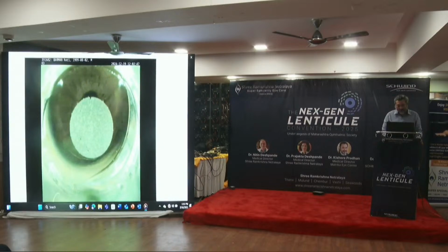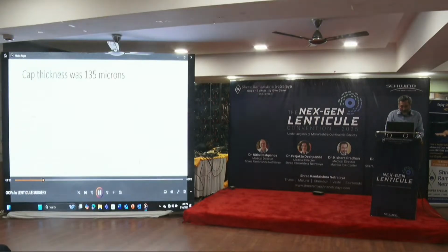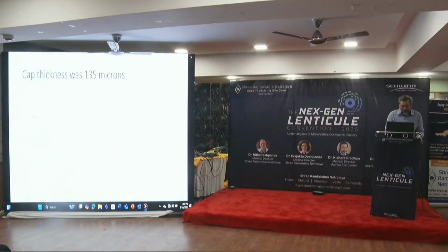If more than 90 to 95% of the cap has been done, I can actually go with only the cap treatment. This is my fellow actually. Only a cap treatment, all right? So this patient, the cap was about 135 microns. So we did a LASIK on this patient, but you can also do a trans-PRK, or you can also make another lenticule on the cap with a 100 microns cap, but you have to be about 30 microns minimum above the old cap, the old refractive bed.